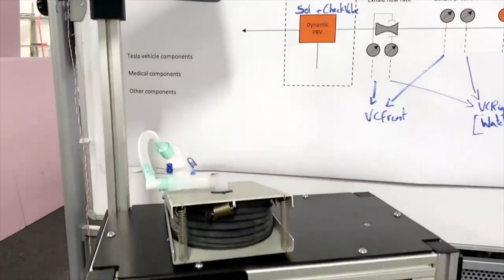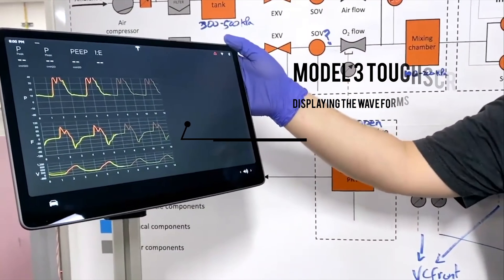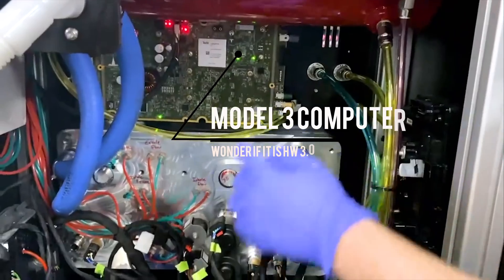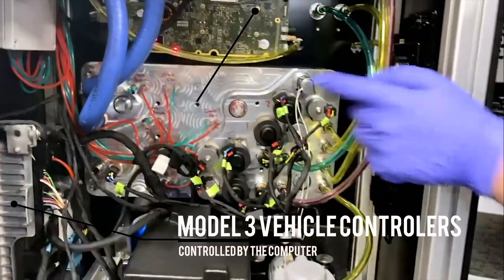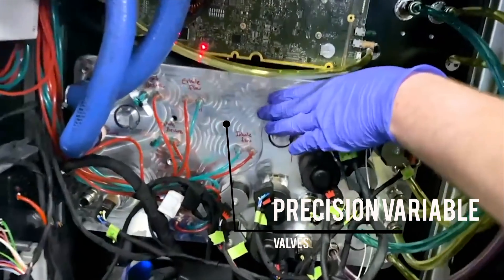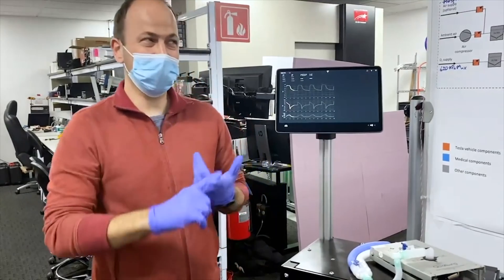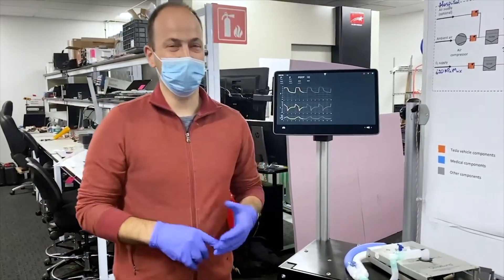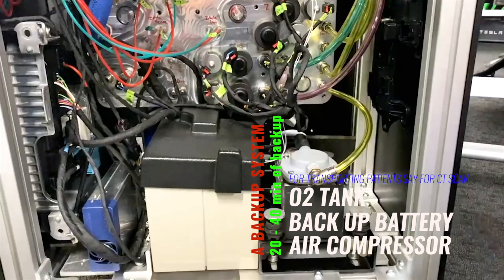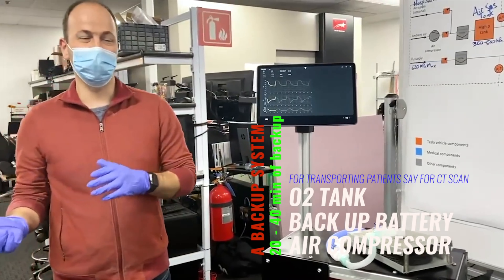This system is powered by the Model 3 infotainment system. Up at the top we have a Model 3 center display touchscreen, powered by the Model 3 infotainment computer, which controls Model 3 vehicle controllers. These vehicle controllers talk to precision variable valves on a single-piece manifold, designed to be easy to put together. This gives us three different ways to control what's happening to the patient: pressure regulated volume control, pressure control, or volume control — for maximum flexibility for the most acute patients. We also put in a backup system on the bottom: with an O2 tank, backup battery, and air compressor, you get 20 to 40 minutes to move that patient where they need to go to get the care they deserve.